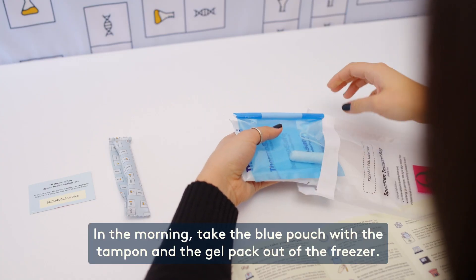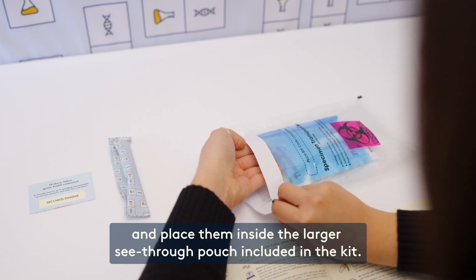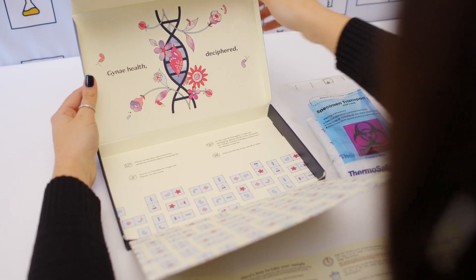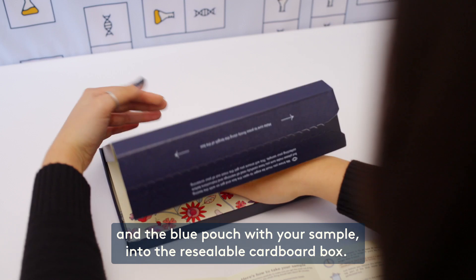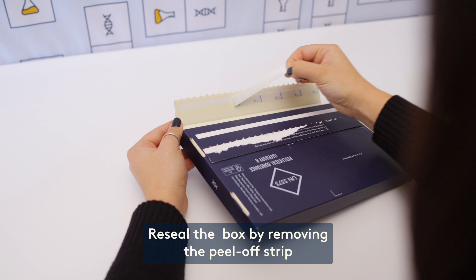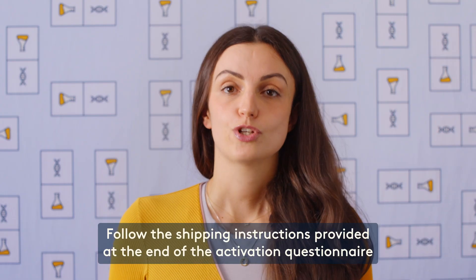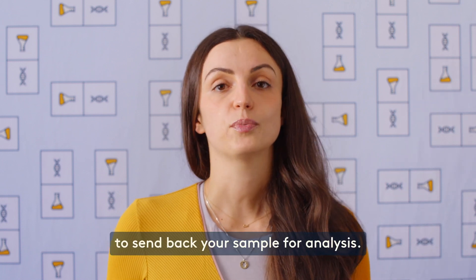Keep the blue pouch with the sample in the freezer to freeze overnight. In the morning, take the blue pouch with the tampon and the gel pack out of the freezer and place them inside the larger see-through pouch included in the kit. Use the seal on the big pouch to close it up. To ship the sample, place the see-through pouch with the gel pack and the blue pouch with your sample into the resealable cardboard box. Re-seal the box by removing the peel-off strip and firmly pressing the tape against the marked seal area. Follow the shipping instructions provided at the end of the activation questionnaire to send back your sample for analysis.